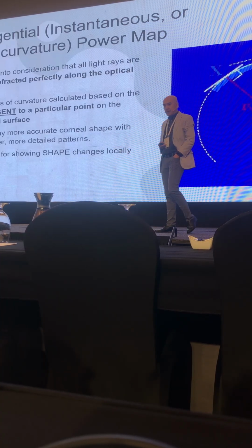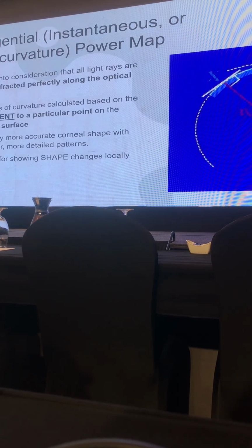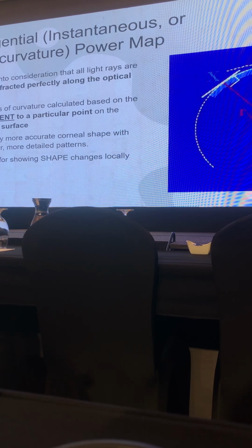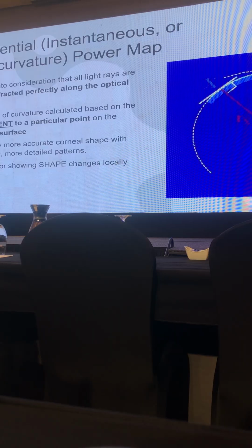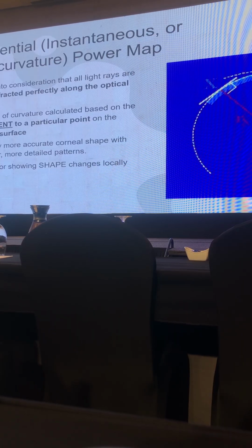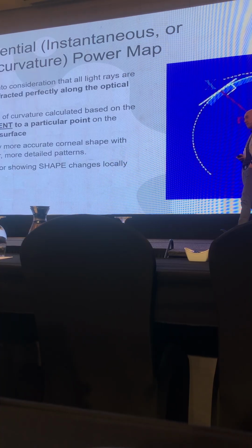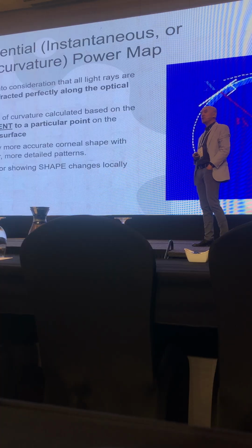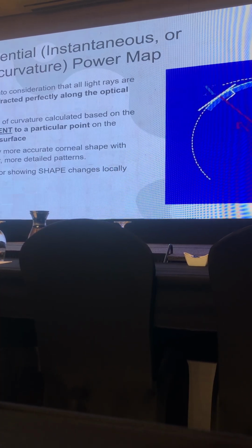So that is something we want to teach you more about, the science behind it, not just teaching you how to fit the lens only. We want to make you understand from the really basic fundamentals so you can be a really good orthokeratologist, and down the track later, maybe practice in your own country as well. And also in Ortho K, you want to know whether your lens fits properly, whether the lens fits centrally.